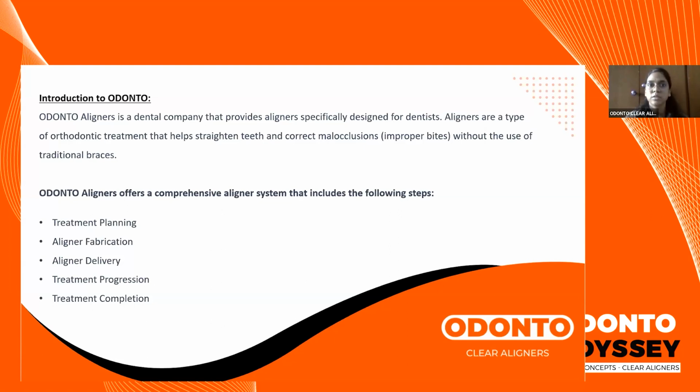Sometimes there are molars or premolars which have been lost, and you want to gain space so that you can provide a prosthetic replacement for that missing tooth. In those terms also, we help you with planning as to what is feasible and what is not possible, and if there are any limitations to that.